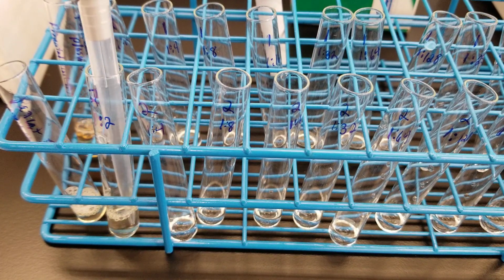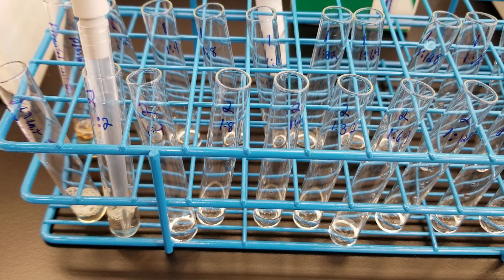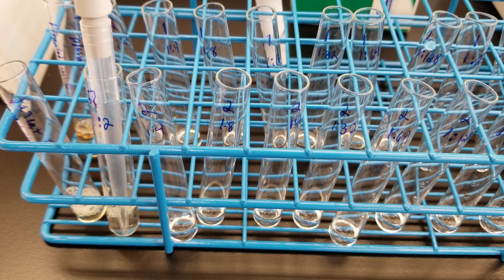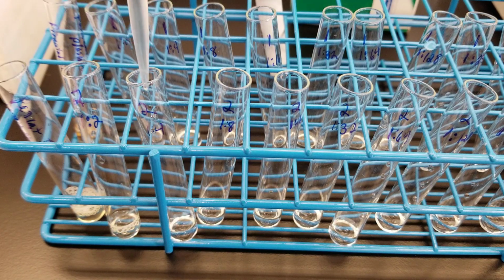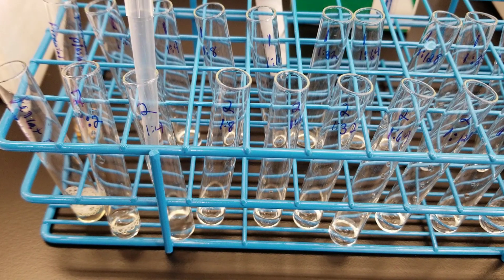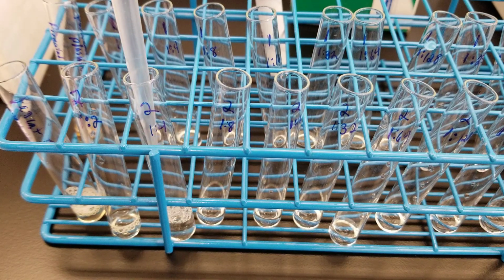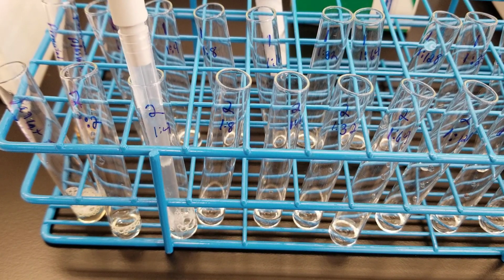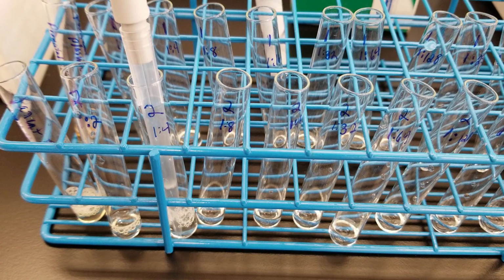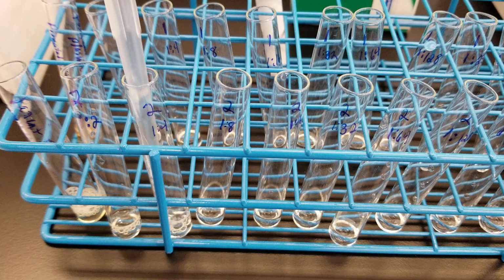and then we will resuspend gently. So at this point now, I have 1 ml of the dilution in there. I'm moving it over, so now this will have 1 ml. And since I'm going to continue to do that in the same fashion, at the end we have the throwaway tube, so that the end result will continue to be at 0.5 ml.